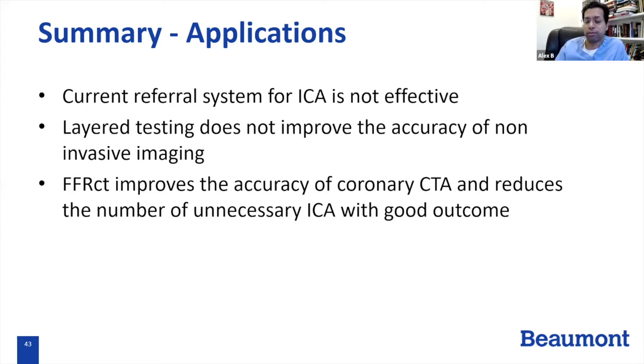That's smart. Now, when you do the non-contrast CT, just in general, do you actually score it, or do your techs just eyeball the location and say, well, the left main is calcified or not? No, we score it. The reason is how it was ordered. One of our orders says with calcium scoring, and if that's what the provider picked, then we score it. The scoring is done almost automatically by the techs on the machine, and then I just put the number in.